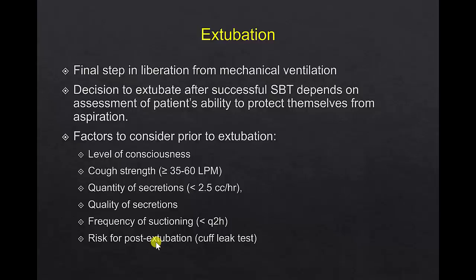Another thing we can do on the other end, if someone's been intubated a couple of days and they fail their cuff leak test, I wouldn't necessarily not extubate them, but a lot of practitioners give a moderately large dose of dexamethasone or another corticosteroid, such as about 10 milligrams of dexamethasone, and at least delay extubation for 6 to 8 hours until the steroid effect takes hold. So this cuff leak test is a very inexact science and has to be really taken with a grain of salt, but it has some utility as long as you understand its limitations.